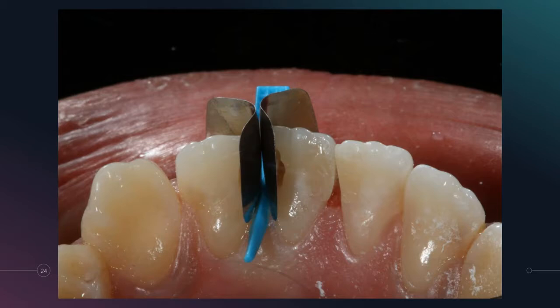The last thing I want to mention is a common misconception with people who are new to this system: that you want the band almost like a right angle where it sticks out in a similar orientation to where that blue wedge is. And I'll go over this more here in a minute, but what you really want is as the band curves around the tooth, you want the part that's sticking out towards your restoration to follow the tooth, the line angle of the tooth. Really, you want that band to curve around the tooth, and that's going to help you maintain that marginal seal of that matrix band, the seal of the matrix band up against the tooth, to help you limit how much actual finishing and polishing you have to do.